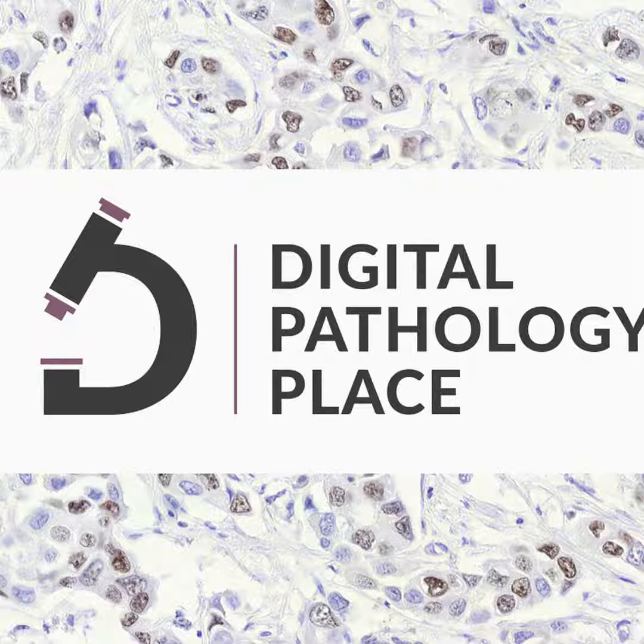And again, this is a 510K, so the proper term is clearance and not approval. That's, I think, the most confused term when you talk about something that the FDA said yes to. So it's a cleared system, and generally when you clear something, that means it is substantially equivalent to a so-called predicate device. We'll go into that a little bit with our studies as well. So that was the fifth system.